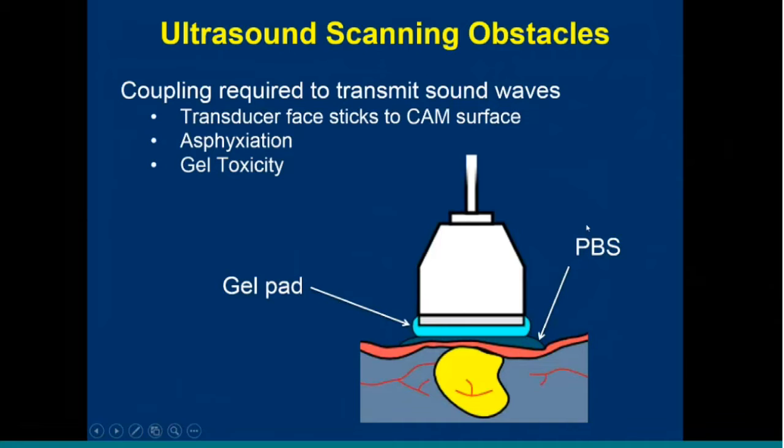A second thing to consider is that the CAM is the main source of gas exchange for the animal, and so the simple solution of just flooding the surface with water really isn't going to gain you much.